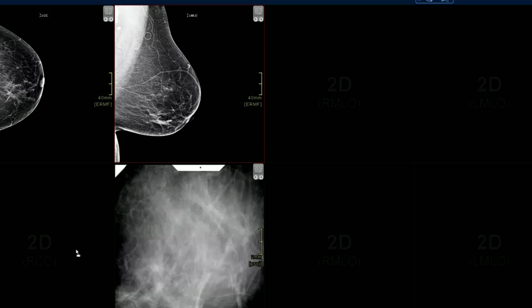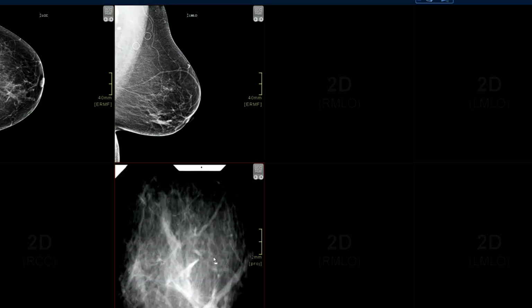So naturally, when we did her MR, we did her ultrasound, we did everything, we didn't see anything. So we then said let's do a stereo biopsy. And this was again me. And then I had to give up. Every time we positioned her, we saw vessels in the way. This is a big vessel. Can you see that? If she had started to bleed, that would have been terrible. So what option did we have? We decided to go under MRI, because in that you compress the breast differently, and then we did it. So stereotactic biopsy is for microcalcifications, asymmetries, and architectural distortions. That is what it is for.